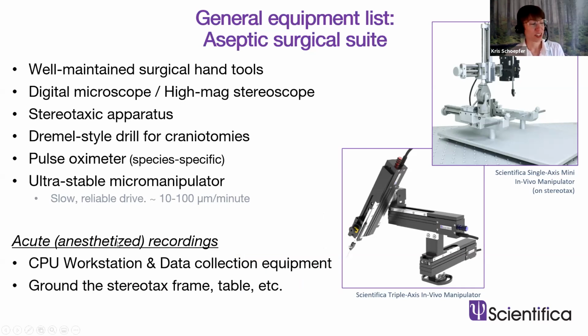Okay, and as I mentioned, if you're taking an acute or anesthetized recording, you would have all of the data acquisition there with you in that surgery space. And don't forget to ground the stereotax frame, the table, essentially anything that could take on some interference, some electromagnetic interference, I guess, from the environment, because you don't have a Faraday cage typically to help block that.